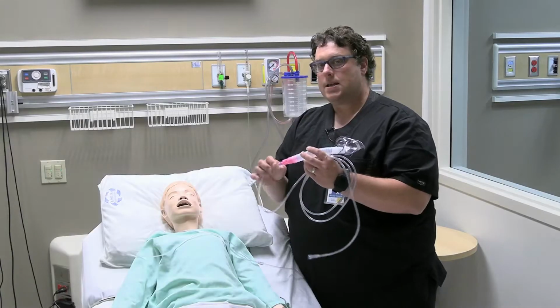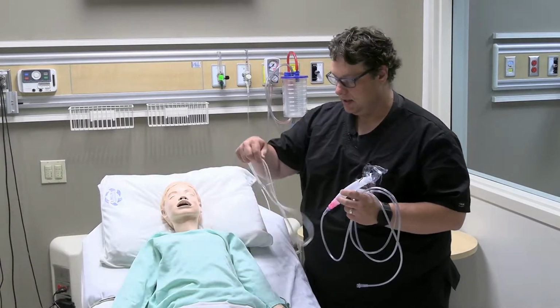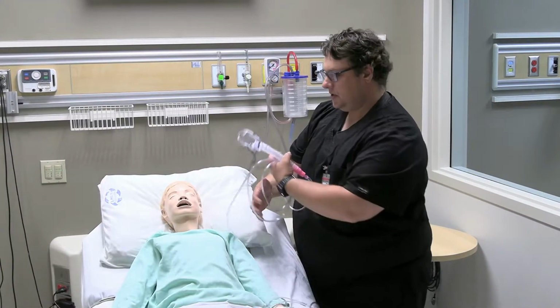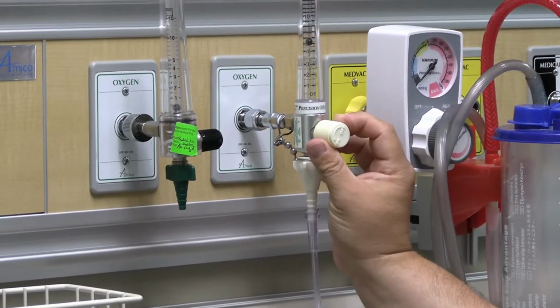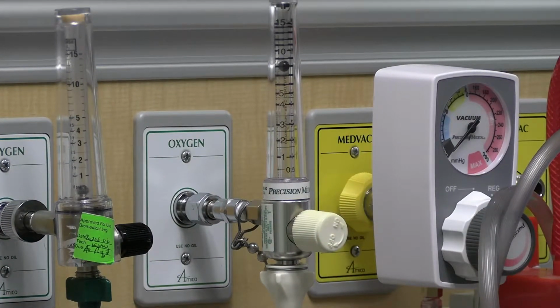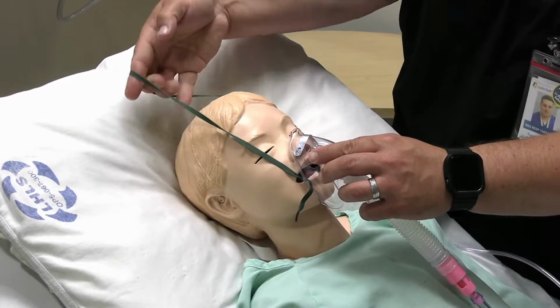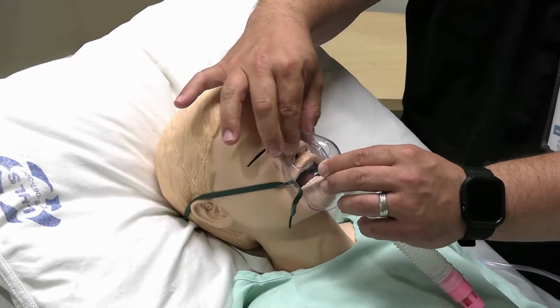Again, we've chosen the 40%, 8 liter per minute pink colored Venti piece. So we're going to come over to our flow meter. We are going to remove our nasal prongs, attach our Venti, and turn that up to 8 liters per minute, again using the ball float as your indicator. The middle of the ball should be right at the liter per minute that you choose. So again, the ball is at 8 liters per minute there. We're now going to apply the mask to the patient just like so. And then, using the straps, slide the straps in behind your patient's head, just like that.